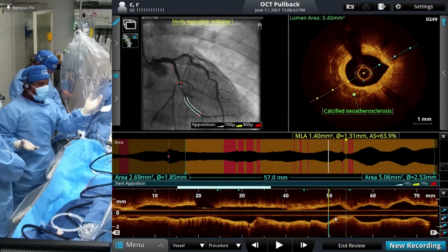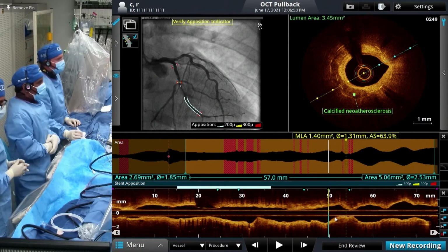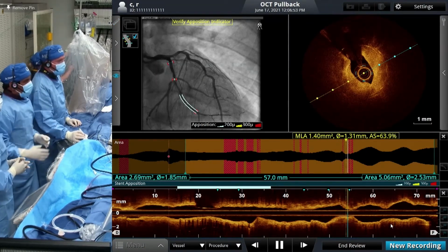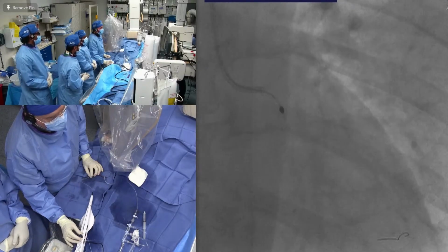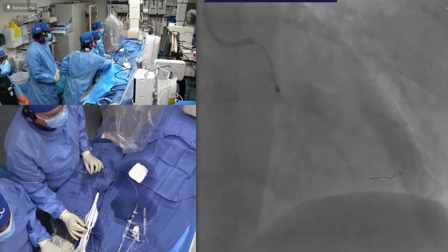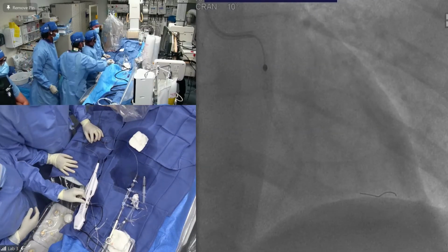As you know, it's multi-layer, and our goal will be to do IVBT. These are the cases where we don't have a drug-coated balloon, and we'll hear from Colombo. Looks like Antonio loves the drug-coated balloon now. Maybe once it comes, but here we have only IVBT. So what we are doing now is a 2.0 burr. 7 French radial. Yeah, 7 French radial. If somebody wants to know, on the radial we are putting a 7 French. And it's a 2.0 burr, right? It's a large burr. Give a little atropine.